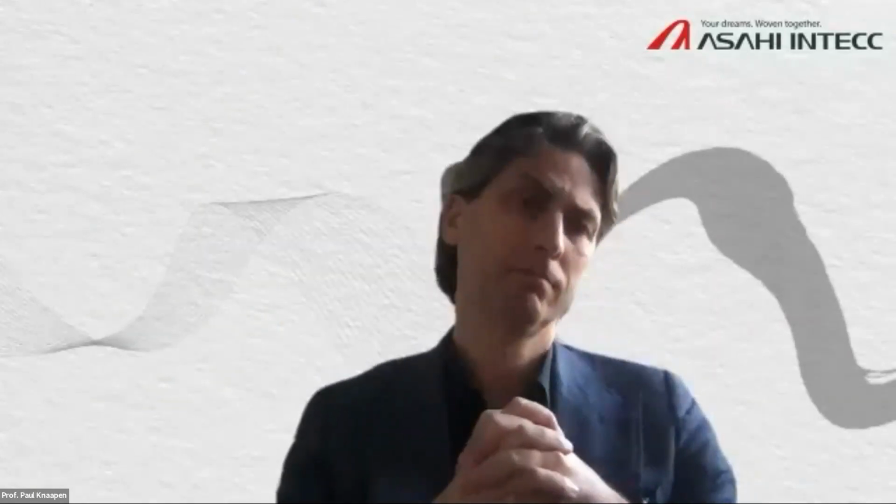Kambis first. Yeah, sure. As you know, I really like to start with the Fielder XT R in general. But if I would have only one wire to take somewhere with me, a Gladius would be really a good choice, because I can handle the Gladius very safely as well. Gladius X. Yeah, well, or Mongo.